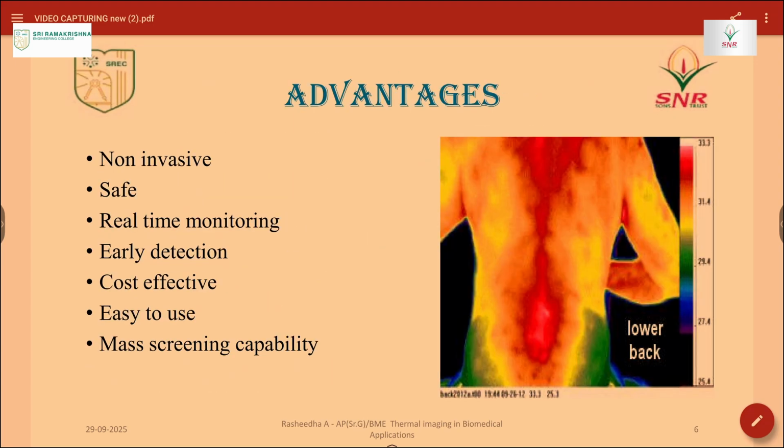The advantages are that it is non-invasive. Yes, it does not require any kind of invasive procedure and it is radiation free. That's why it is called the safest procedure, because in CT and X-ray you will be subjected to radiation. Here this is a radiation free procedure, and it is real time monitoring. That is very important because it monitors the blood flow, circulation, metabolic activity and the pathological changes too. The main and unique advantage of using this thermogram is the earlier detection.